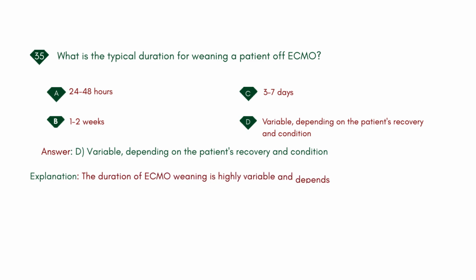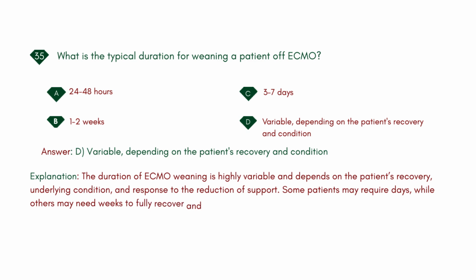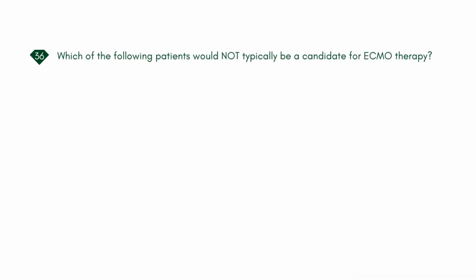Explanation: the duration of ECMO weaning is highly variable and depends on the patient's recovery, underlying condition, and response to the reduction of support. Some patients may require days, while others may need weeks to fully recover and be safely weaned off ECMO support. Which of the following patients would not typically be a candidate for ECMO therapy?